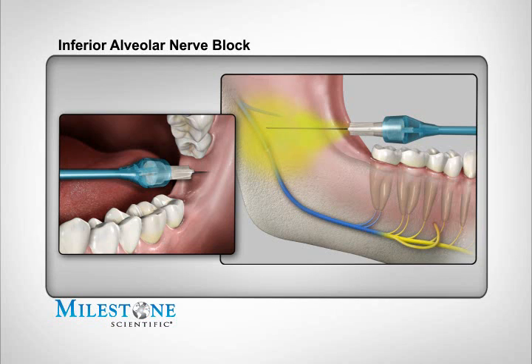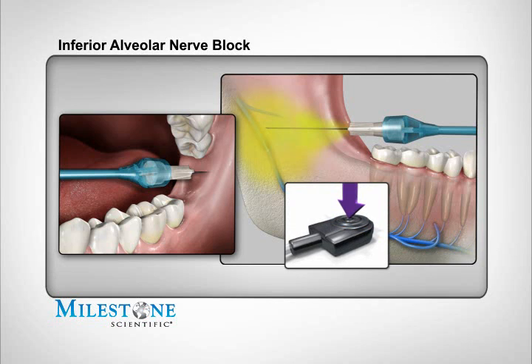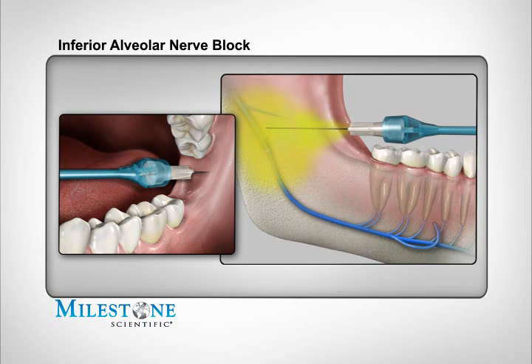Continue the injection by depressing the foot control pedal. It's recommended that the first 1/4 of the cartridge be dispensed using the control flow rate before transitioning to the second faster rapid flow rate. The rapid flow rate is used during block injections only after your patient has acknowledged that they have achieved soft tissue anesthesia of the area being injected. This is acknowledged by subjective statements elicited from your patient.